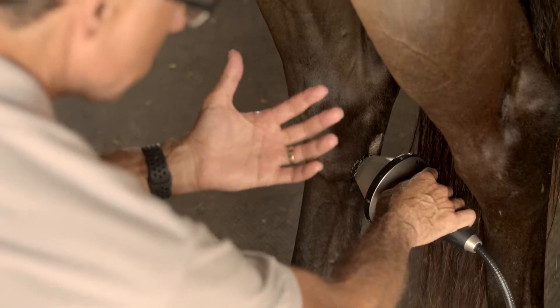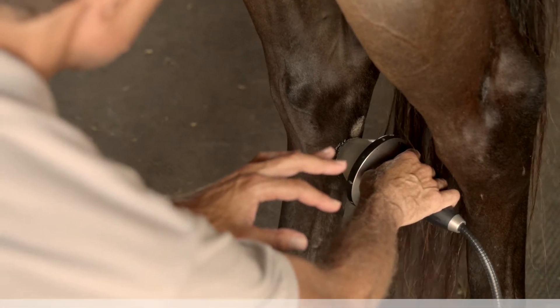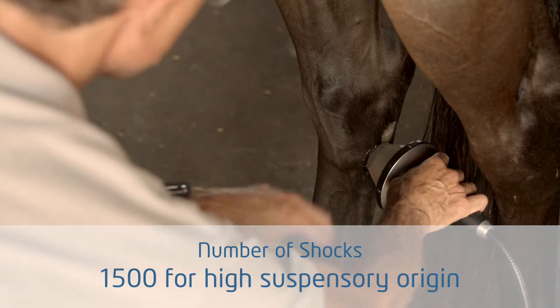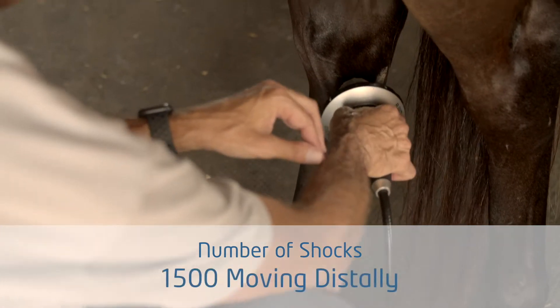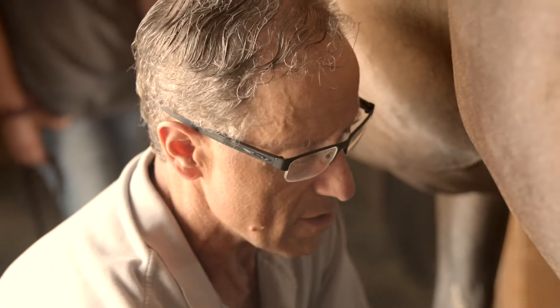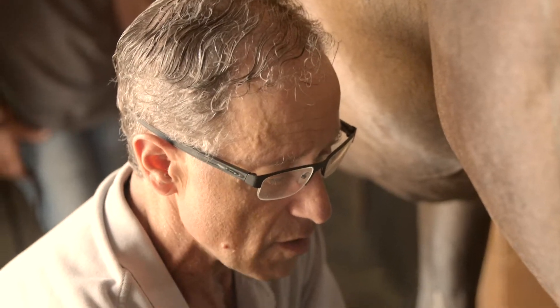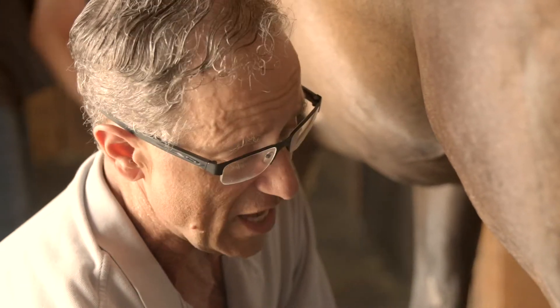To do a thorough treatment on this area, I use between 3,000 and 4,000 clicks. This particular area gets 1,500, then I'll migrate down and do another 1,500 to make 3,000, and then I'll put 1,000 right there at the middle joint of the hock. One of the things I love about this is that you can treat a horse more frequently. How you charge for it is a personal opinion, but be aware there are no operating costs or running expenses when you use the Wolf system, because the probes effectively last forever if you don't drop them.